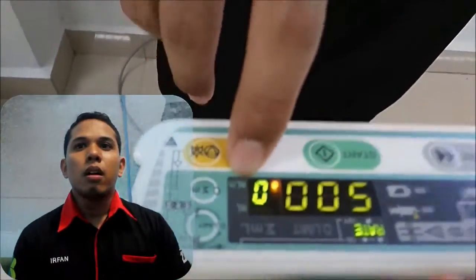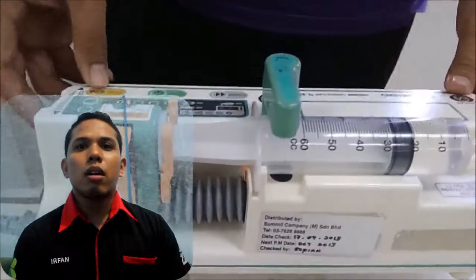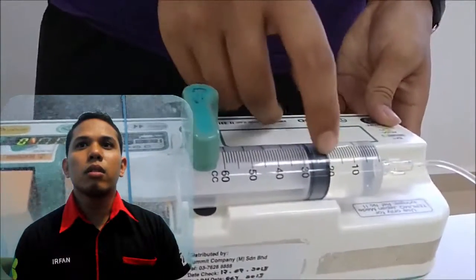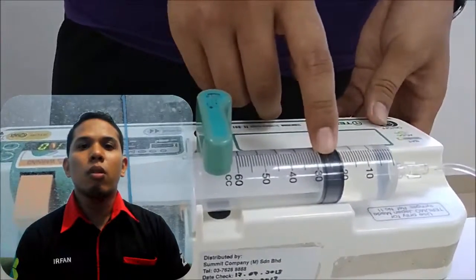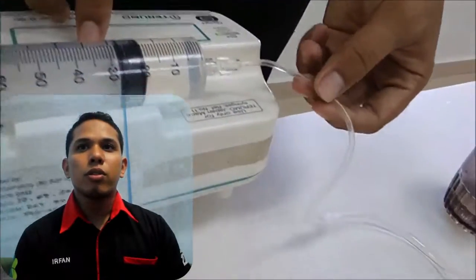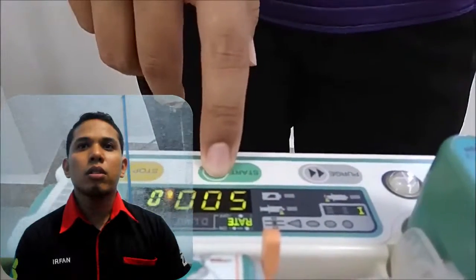Aim: 1. To give the drug in a fine manner with the right dose and amount according to the needs of the patient, with a maximum volume of 50 cc per hour. 2. To ensure administration of the drug with a measured and precise dose.